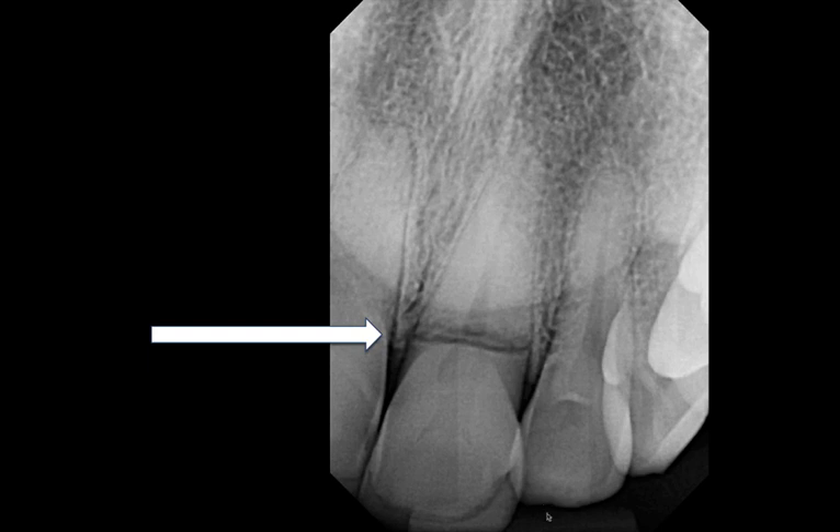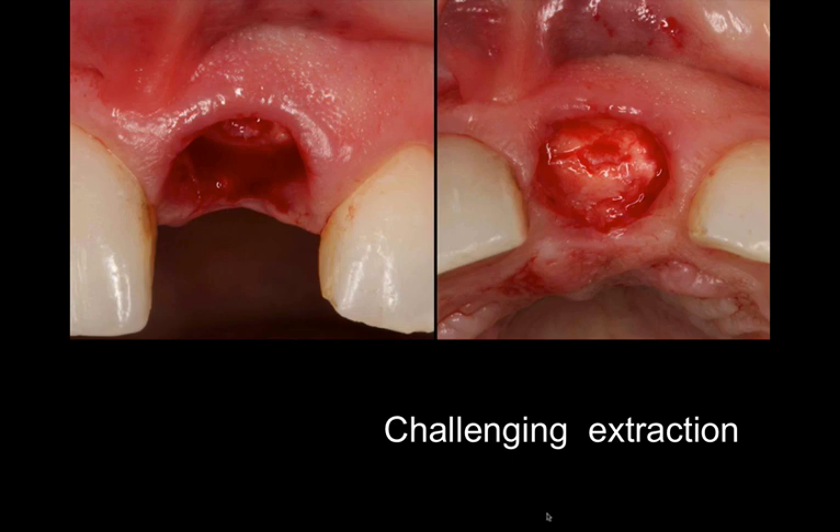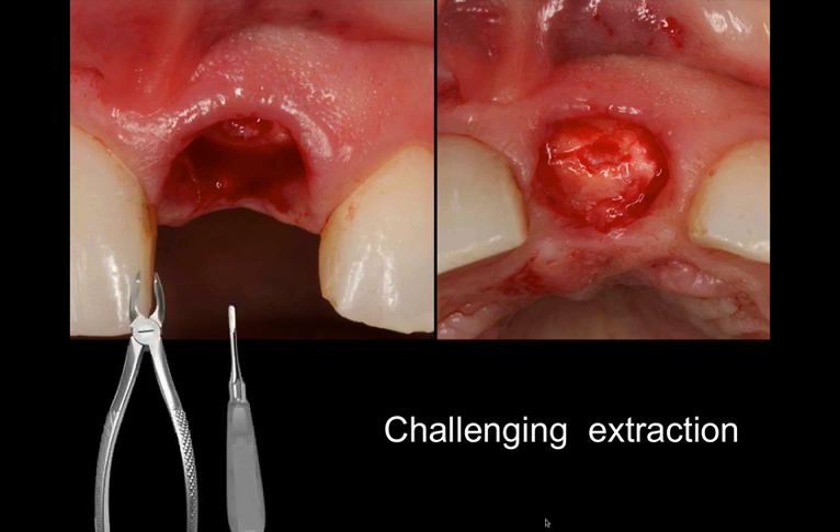When you have a horizontal fracture in an upper central incisor that is subosseous, you will have a challenge or at least a dilemma in regards to what method of extraction you'd like to apply. Using forceps and elevators or more conventional extraction techniques can compromise the soft tissue because you just don't have proper access without damaging the tissue, and of course you have the option to reflect the flap, but that in itself can also be damaging and compromising for obvious reasons.